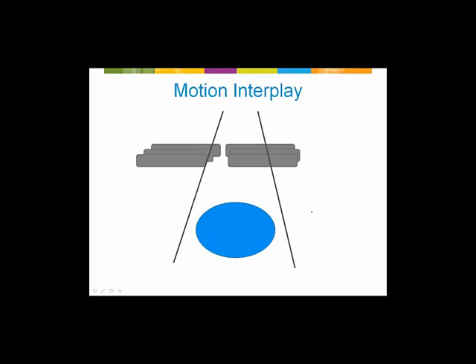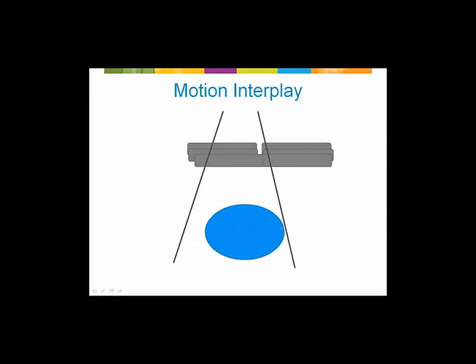There's a really nice paper out of the Harvard Medical School that looked at this effect in great detail for the exact group of patients that we're talking about today. What they did is they took a patient 4D CT scan that they had, and they created a patient model out of that data. So the surface contour was based on that patient. They even went to the detail of creating a tumor model from that same patient and extracting that patient's breathing trace and the motion from 4D CT in order to simulate that motion in their phantom.